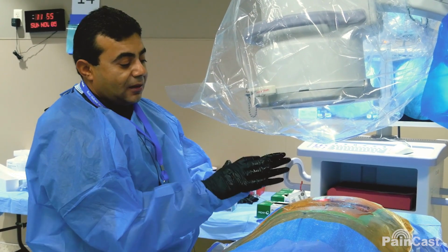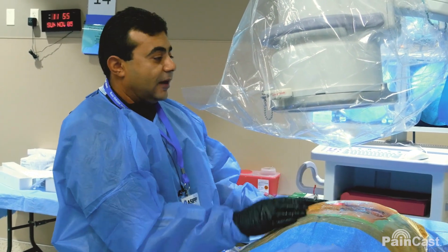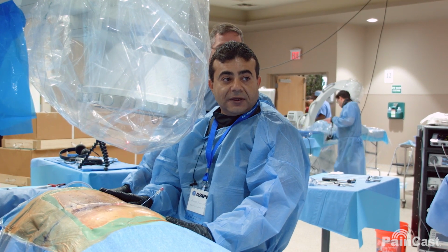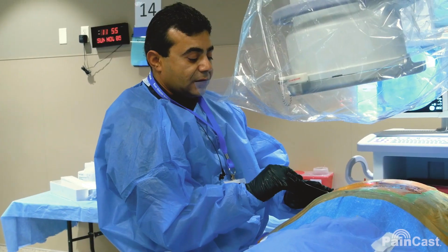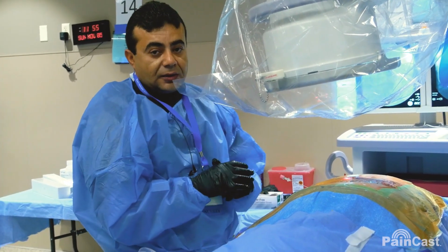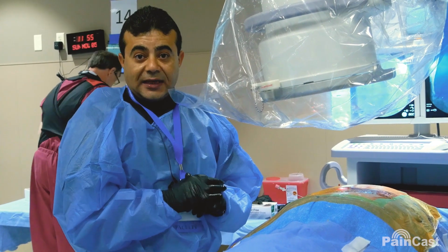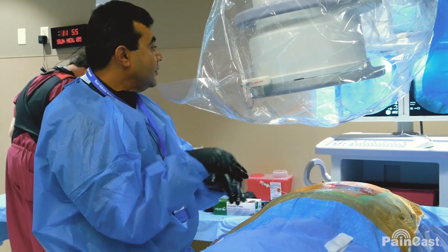Okay, and you want to make the X-ray, you want to square off the end plate of L4, L5. A little bit more. Perfect. Thank you so much. So we go with the trajectory in a 45-degree. You want to be very safe. So the way to be very safe is you hit the facet joint first, and then from there you're going to walk to go down.